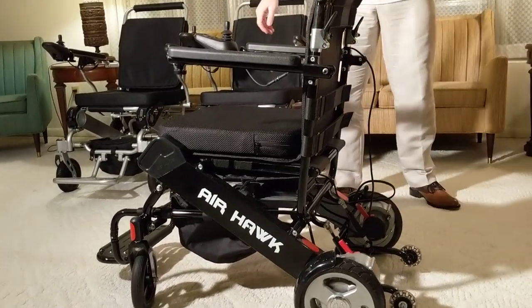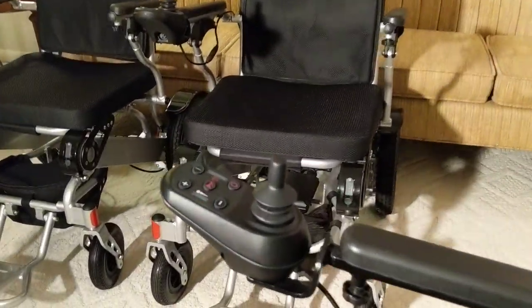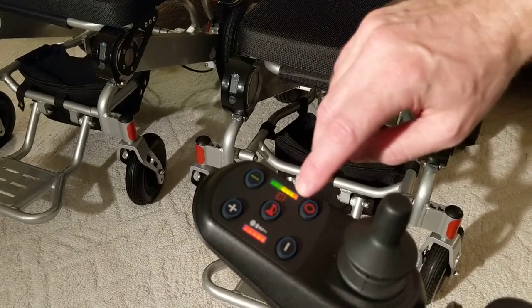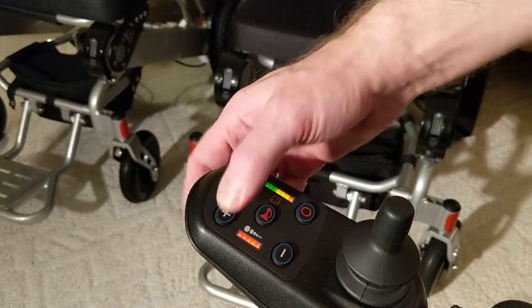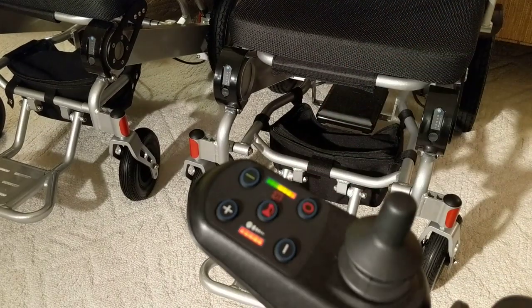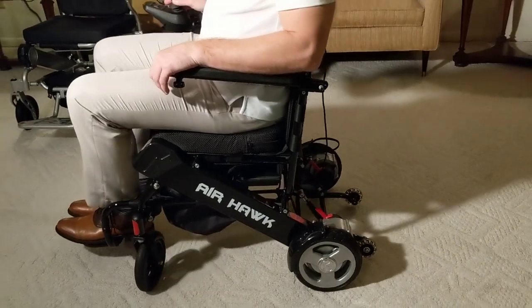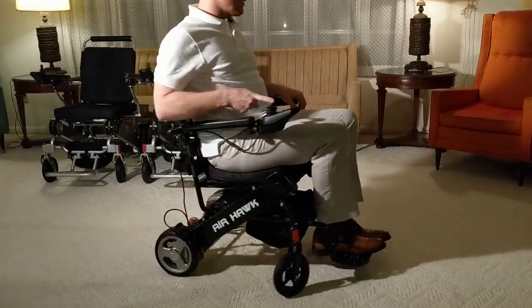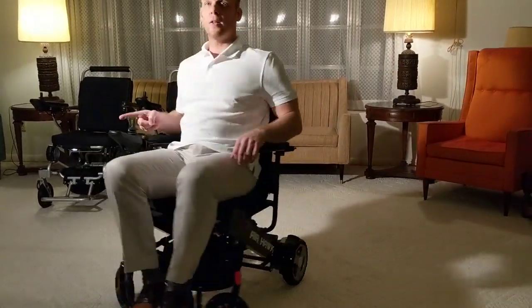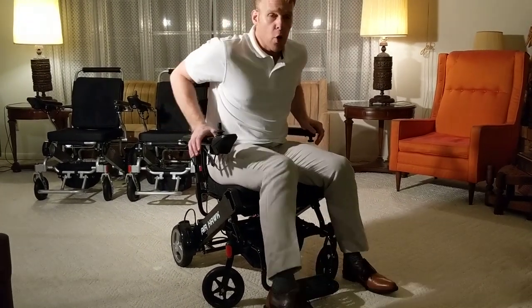To turn the chair on, you have a very simple controller where you can see how much battery you have, and with a simple push of a button you can control the speed. It even comes with a horn. Sitting in the Airhawk, I'm going to show you the turning radius — literally with one finger, you can see how easy it is to maneuver.